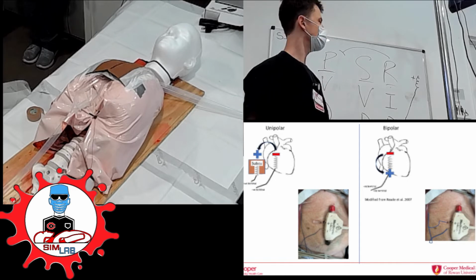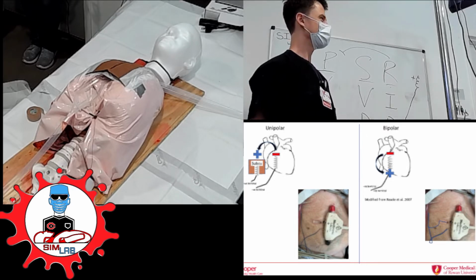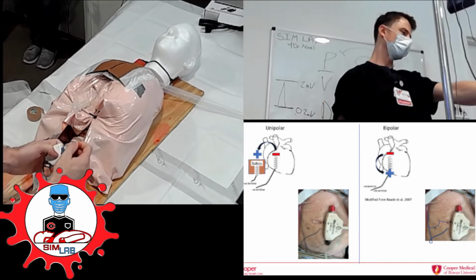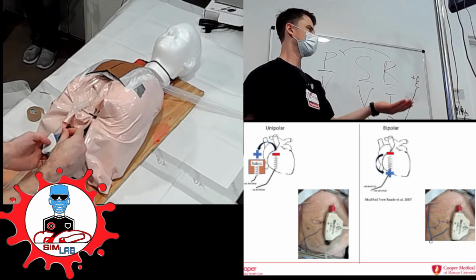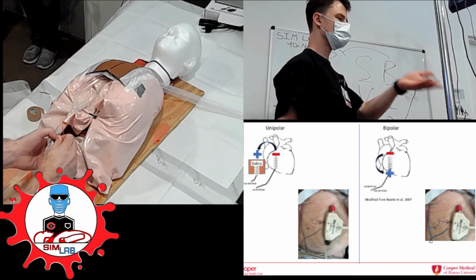Switch polarity. Just polarity. Okay. So how do you do that? Physically switch them. Show the folks at home. Okay, so what he's doing is switching the negative and the positive connections here. It sounds like it wouldn't do anything, right? But it actually sometimes just helps you get capture again. So just literally switching them out right there.